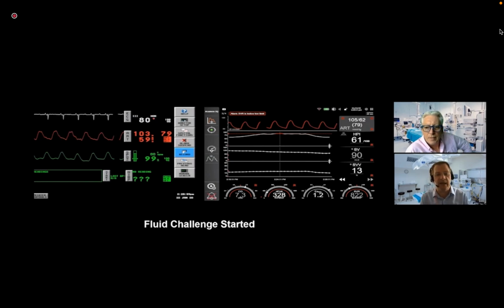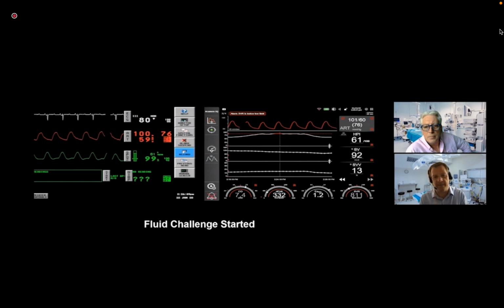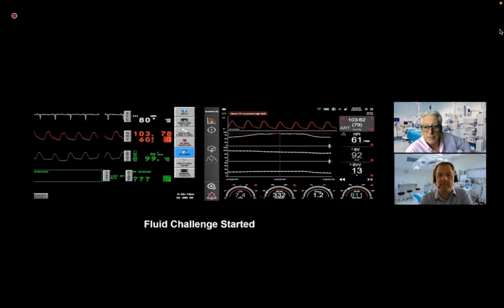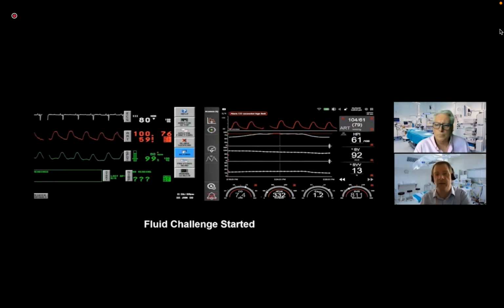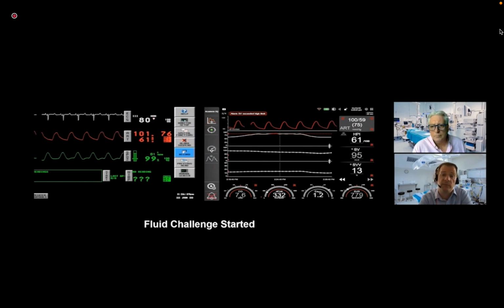And our dP/dt, that measure of contractility, hasn't changed. And therefore, by default, we know it must be a problem with some vascular tone. So yeah, absolutely, fluid and a little bit of phenylephrine. But in this example here, fluid on its own is doing the trick. Yep, our baseline blood pressure was, I think, 69 millimeters of mercury, and we're now up to 75, 77 there. So giving the fluid has improved or maintained our blood pressure. Although interestingly, HPI is still raised.